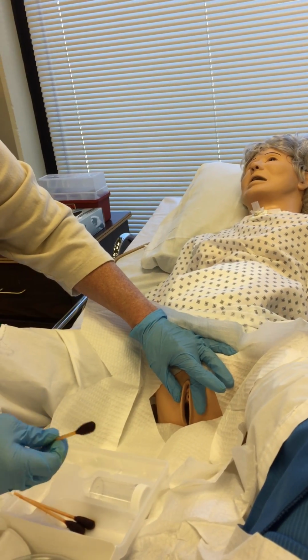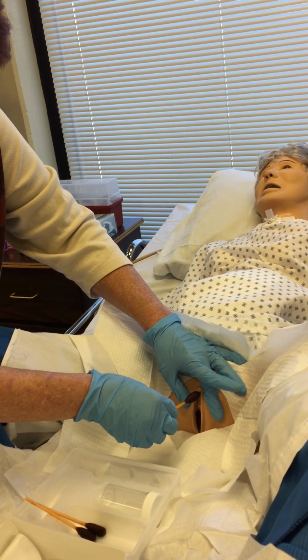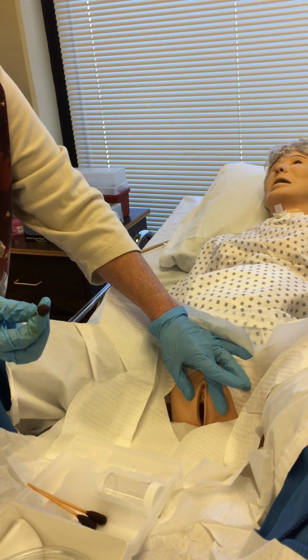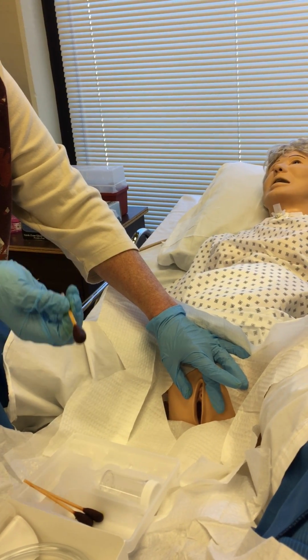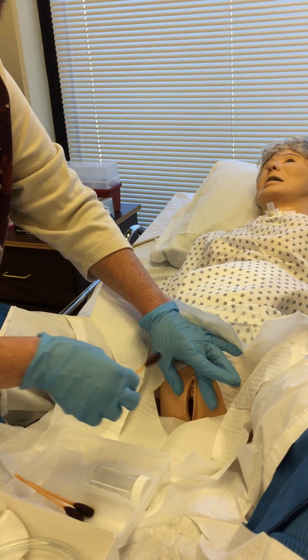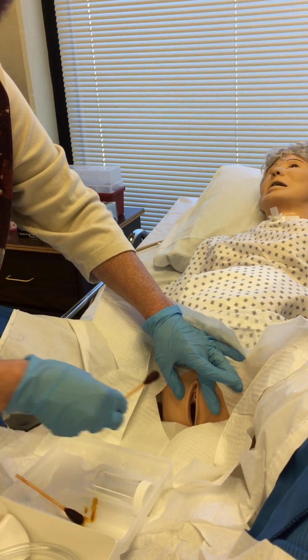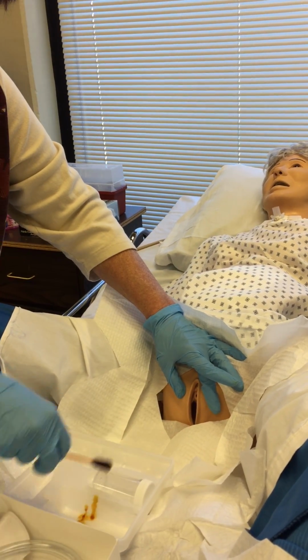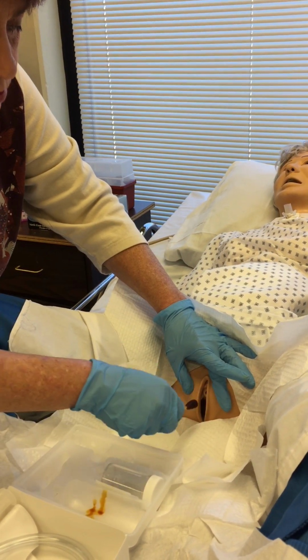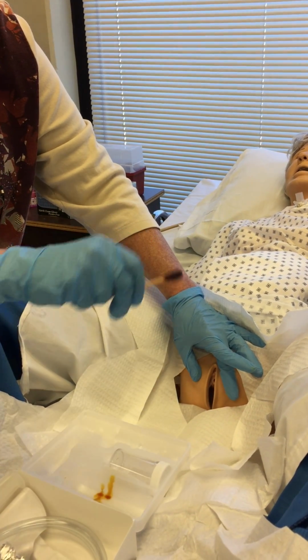So we're going to clean, not out here. We're going to clean on down in here, and we're going to go cleanest to dirtiest. This is where people get confused, it's the opposite of wounds, because the dirtiest part is going to be the part where the pee comes out. So you're going to clean the far side, pitch it. You're going to clean the near side, pitch it, and then you're going to clean down the middle. And since this is a female, if you watch very carefully, when you clean down the middle, you might see what we call a wink, where the betadine goes in and out of the urethra.